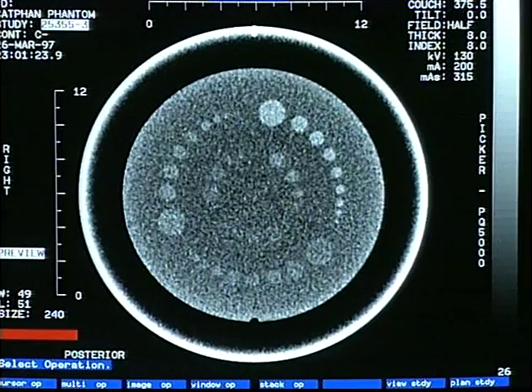For example, a 5 mm spherical tumor imaged in a 10 mm slice, only half of the slice width is occupied by the 5 mm tumor. And we call this an object subslice. It is thinner than the slice thickness. And again, this is an area that we've had to return to as spiral has developed and evolved, because this issue of sub-slice thickness object is very important in evaluating a spiral CT scanner.